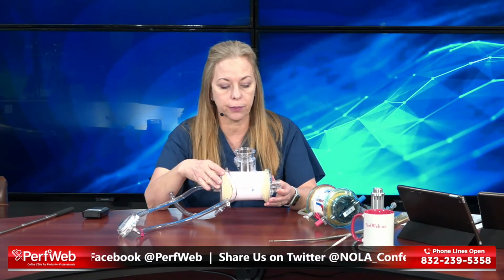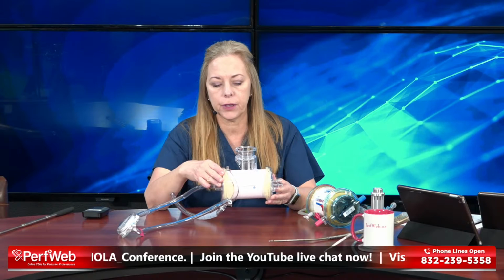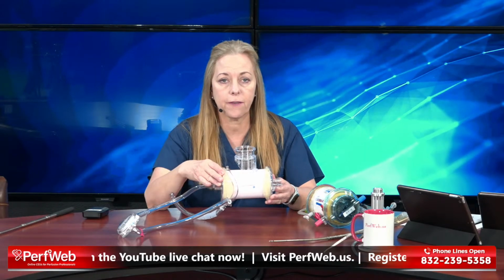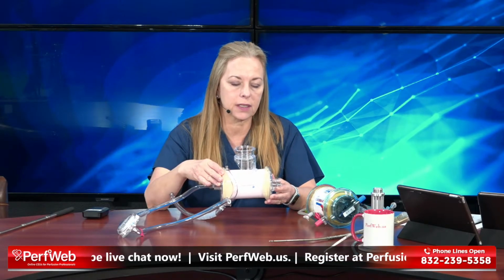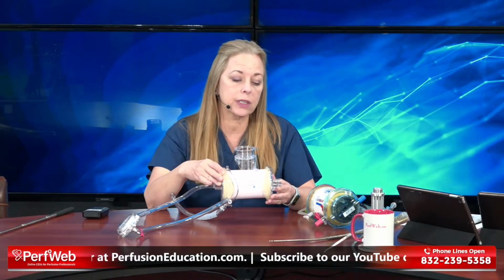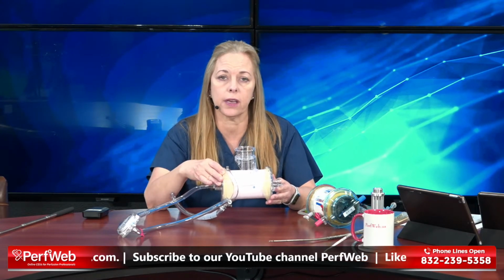Before, we were under the impression that this was anywhere from 5 to 7 days, and 7 days was likely going to be pushing it for its capacity to continue performing well, evidenced by what we have all seen on long-term oxygenators, a foaming kind of thing happening out of its exhaust port. But with the inability to change these out as frequently as we would normally schedule, we had to let them go until we actually saw the performance drop. And we had some of these last regularly 14 days, some even 20 days.